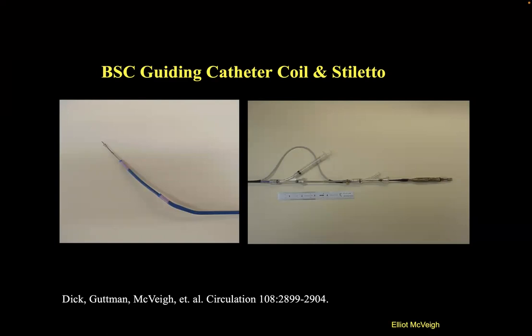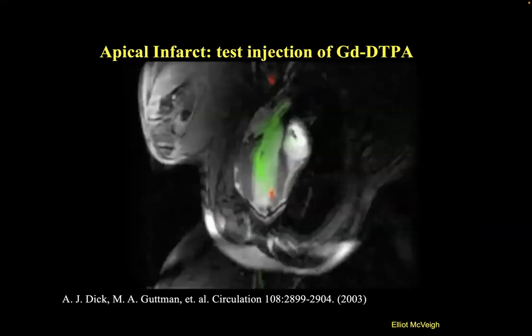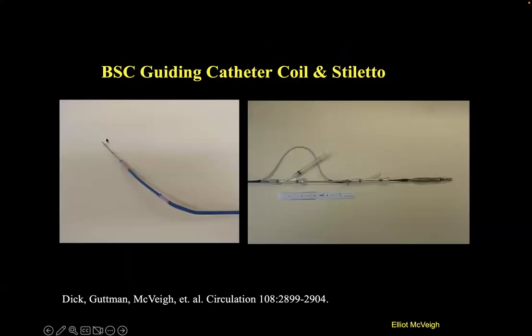So the next application for intervention, and this is of interest to you, obviously, is modifying an interventional device. And this thing is an injection catheter. So you put this down a vessel, and then you use this needle to inject something at a target. So you could inject a very high concentration of, say, a chemotherapeutic agent if you're trying to kill a tumor, or you could inject something to essentially ablate tissue in the myocardium.